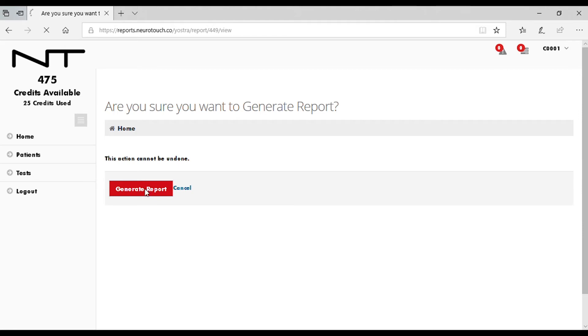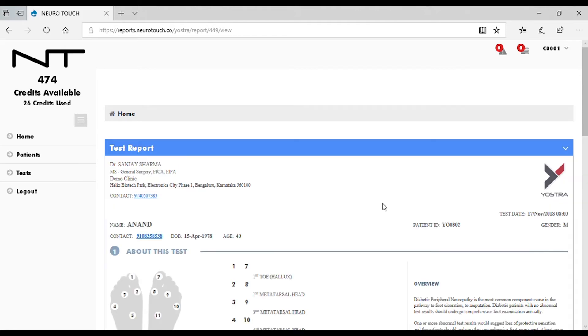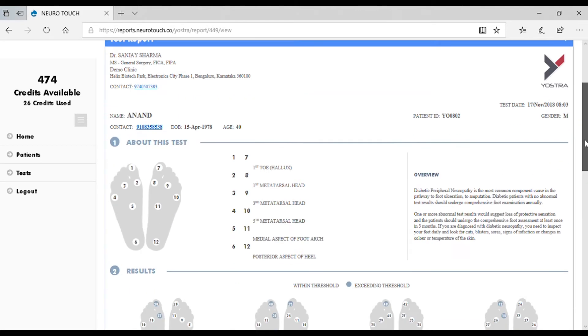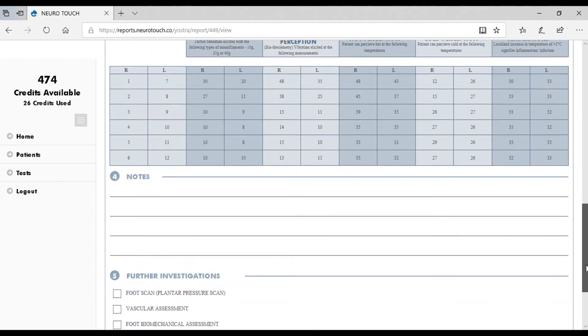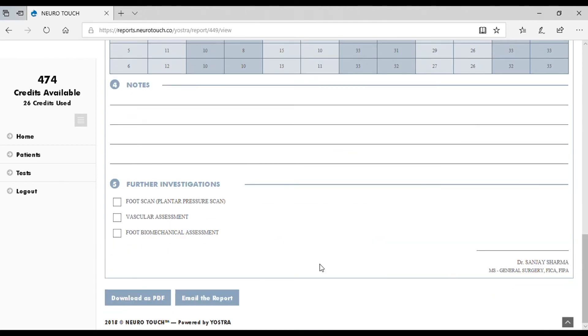Click on Generate Report. The report will be generated on the basis of the data provided. You can either download or email the report generated.